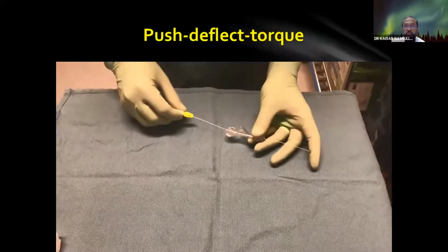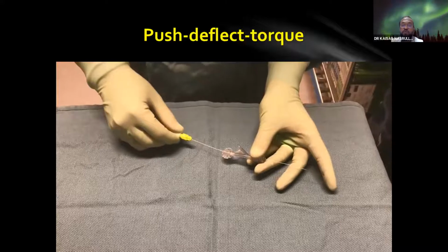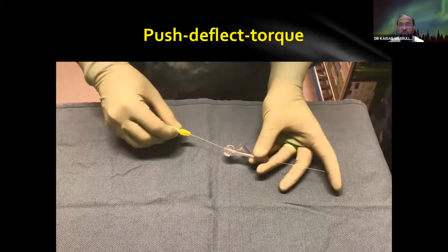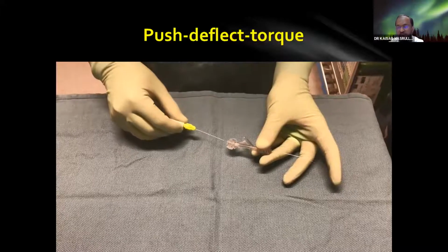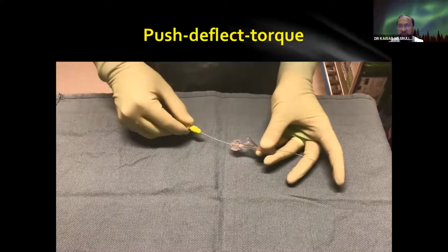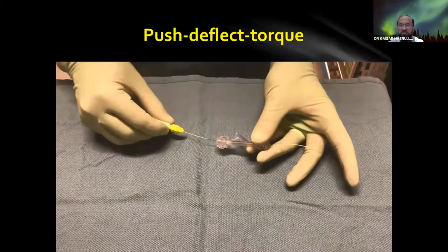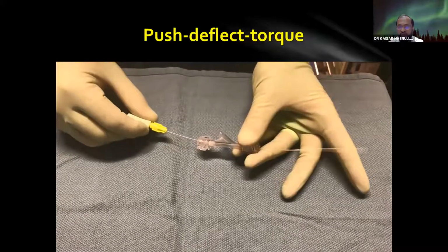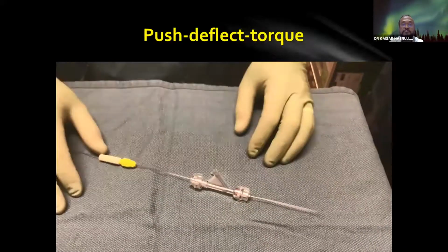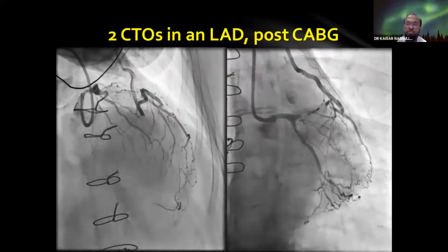Now push, deflect and torque. This is for the Gaia series. You have to push. And when there's a deflection, then you're not in the right channel, then you just rotate and then again go to the true channel. So you use Gaia wires in this technique: push, deflect and torque. So this is another CTO in an LAD post-CABG patient.